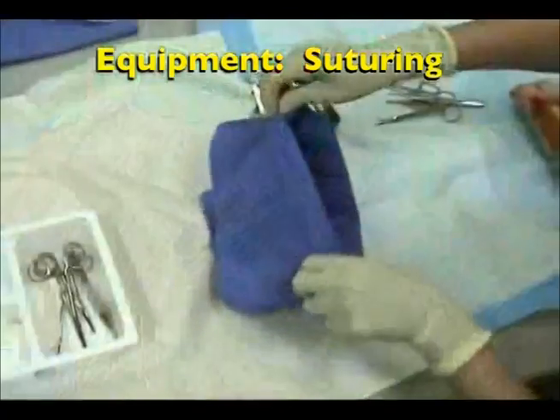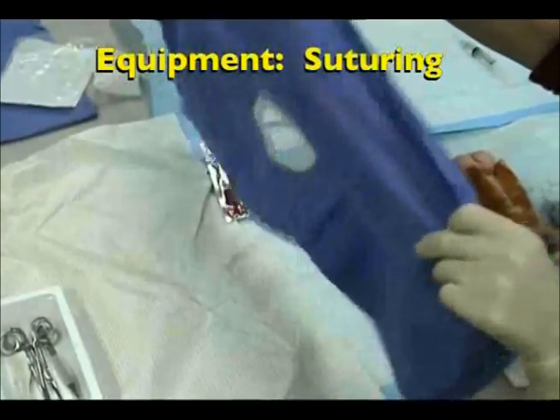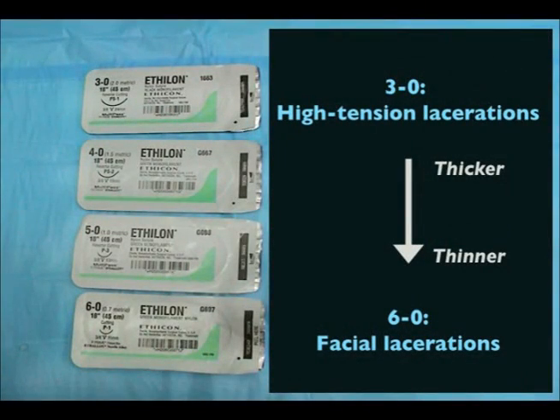Sterile gauze, to wipe away blood and other particulates. And a sterile drape, to maintain a sterile field once wound irrigation is complete. You will also need to select the appropriate suture material, which is not included in the suturing kit.